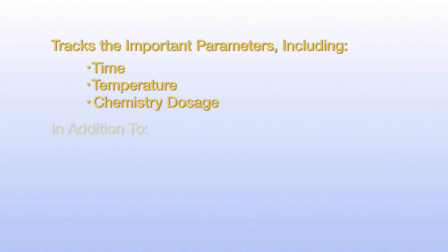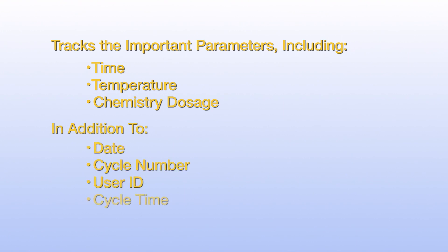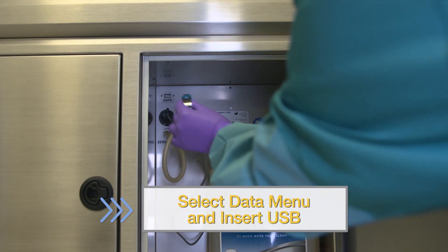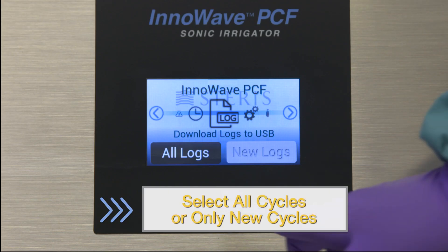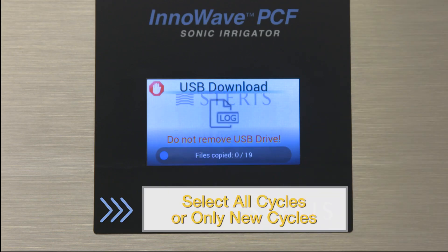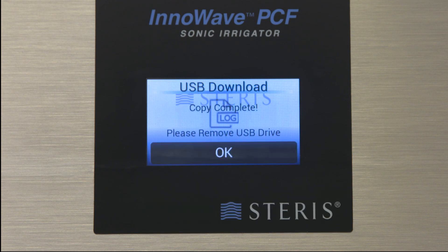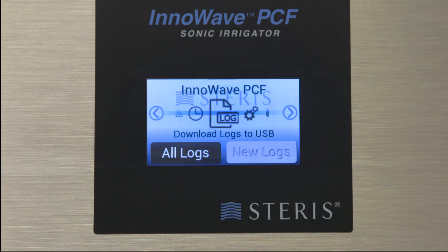This unit also tracks the important parameters of the ultrasonic cycle, including time, temperature, chemistry dosage, date, cycle number, user ID, cycle time, and cycle errors. To download cycle information, select the data menu, then insert a USB drive to initiate the download. You can choose to either download all cycle logs or just the new cycles since the last download. Cycle confirmation will be shown on screen once the download has successfully completed.